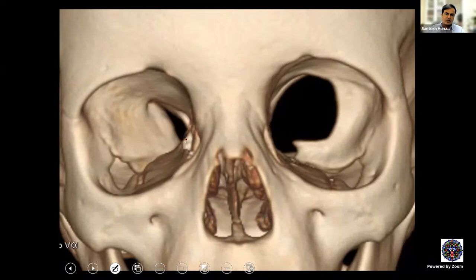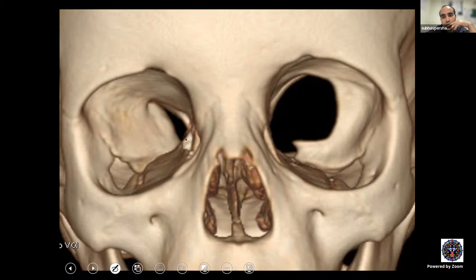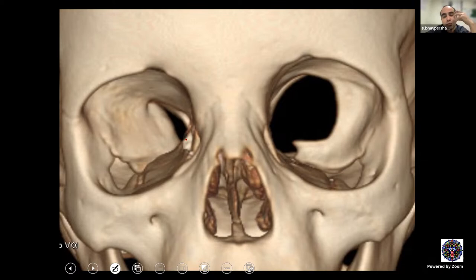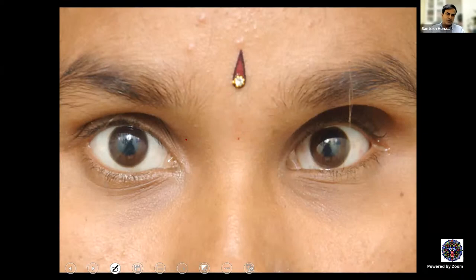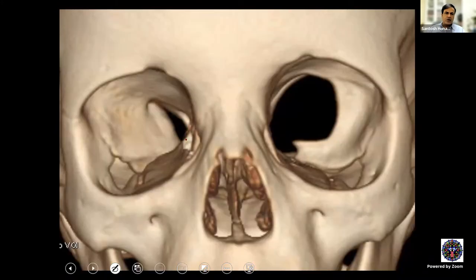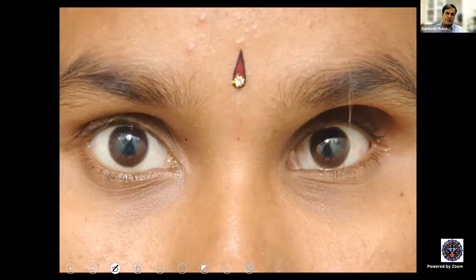Now, what about this? Subha, what do you think this is and what do you expect in this patient? There is a defect in the bony wall involving the greater wing of the sphenoid and also the lesser wing. So probably it is a case of neurofibromatosis. We expect transmitted pulsations from the lobe of the brain — pulsatile proptosis. This is called the bare orbit sign. In a patient who has a bare orbit sign, you can expect pulsatile proptosis, and the patient may even have enophthalmos. This is exactly how this patient manifested.